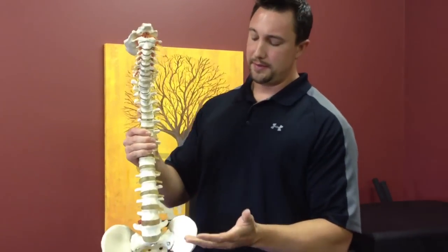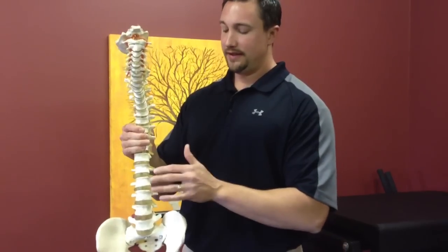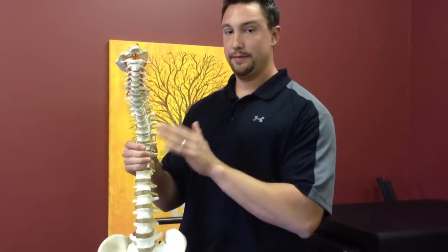Dr. Blake Staker here at Westside Medical, and today we're going to talk about spinal decompression and what it is. When we're talking about decompression, it's talking about the inner discal pressure here in the lumbar spine. You have these lower discs, and each disc has an inner discal pressure dependent on the body position.